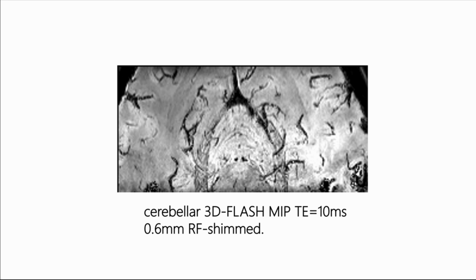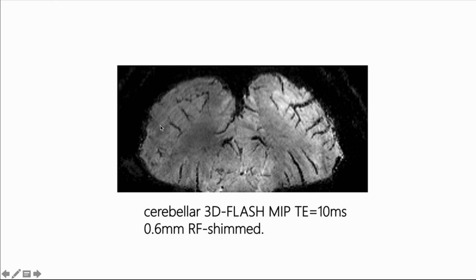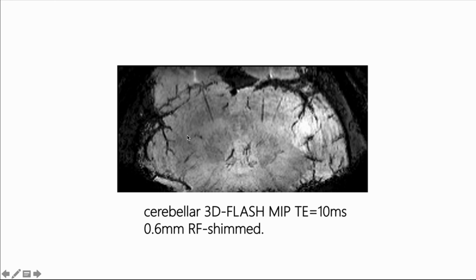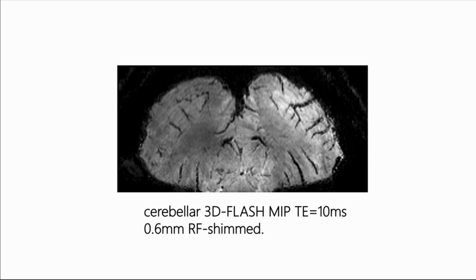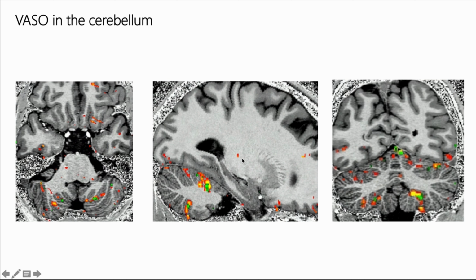The unfortunate thing is, if you notice here on the axial side, you see some black patterns, which are the veins, that are oriented similarly to what we expect our fMRI activation to look like if you have stripes. So that means that it's kind of hard to actually tease them apart from true neuronal activation, the fMRI activation versus venous-related activation. And indeed, if we overlap this venogram to BOLD, which you see here in red, you see that we have a very tight overlap. So that's an issue, which meant that we had to also look for alternative functional acquisitions.